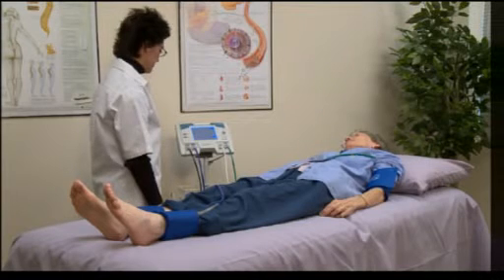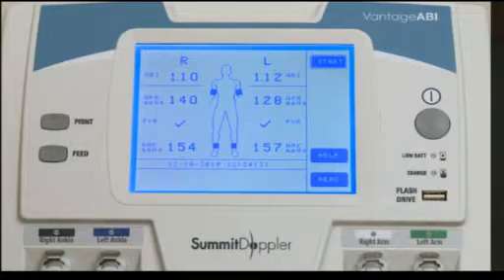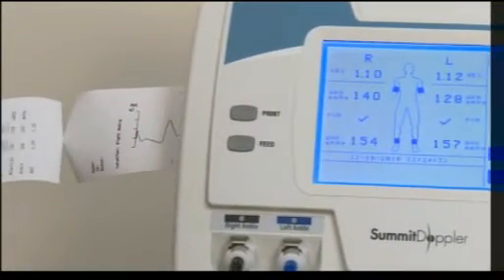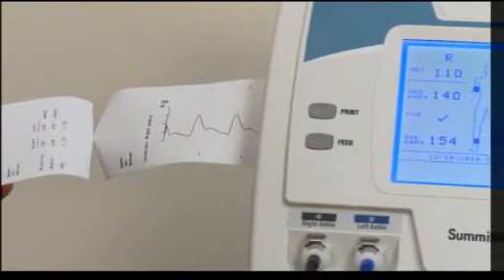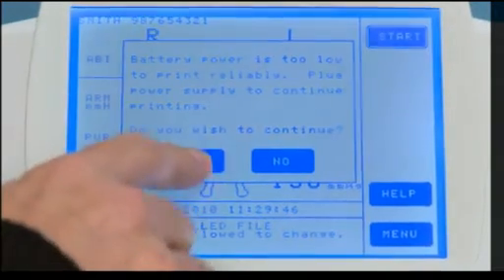After a few moments, the Vantage ABI will display the ABI results. At this point, the exam can either be printed or saved for printing or exporting at a later time. If the battery is too low for printing from the built-in printer, a pop-up warning will appear suggesting the system's power supply be plugged in to complete printing.